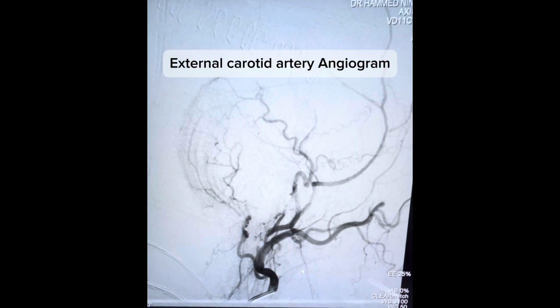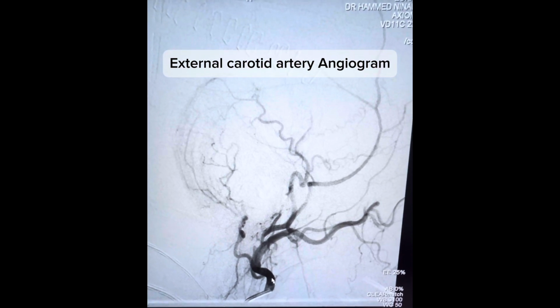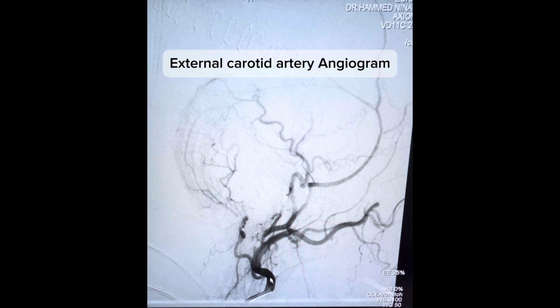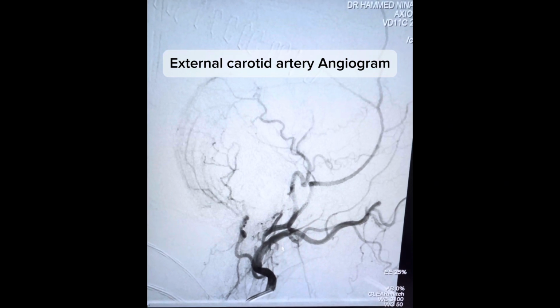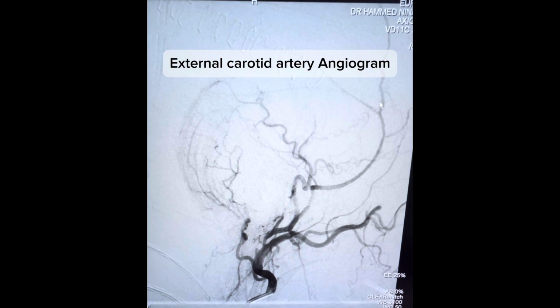Still our third case for the day. So this is the middle meningeal artery embolization. We now have access into something called the external carotid artery, which is the vessel that feeds the outside of the brain. Basically, what we're trying to target is to find a way into this very tiny vessel that goes up here, which is the middle meningeal artery.